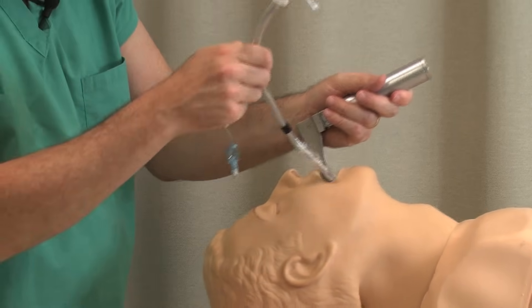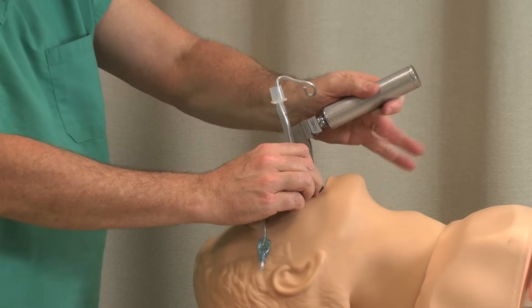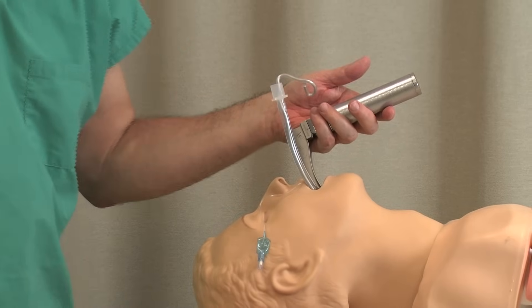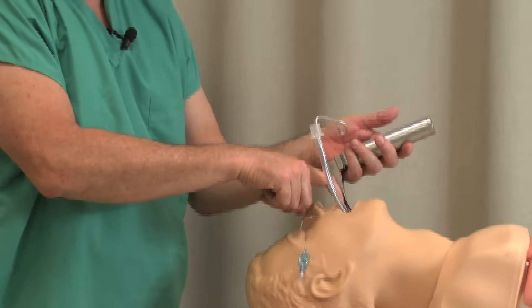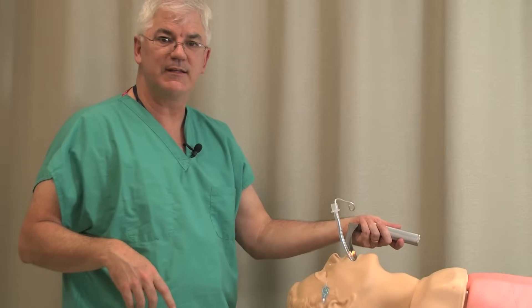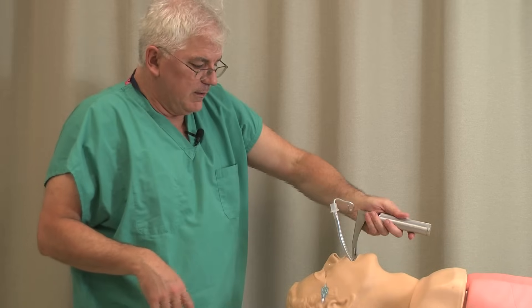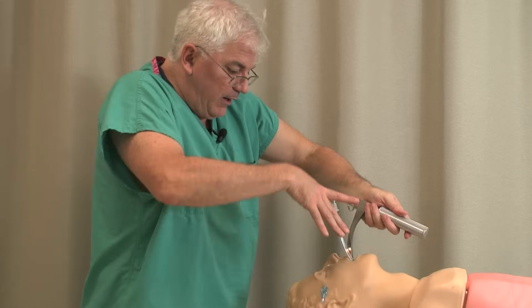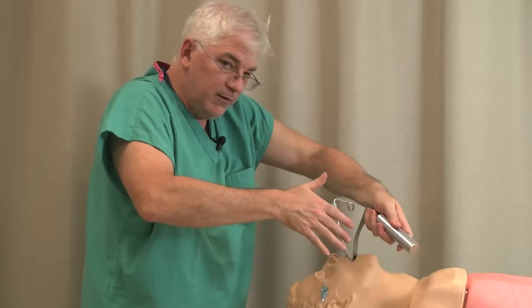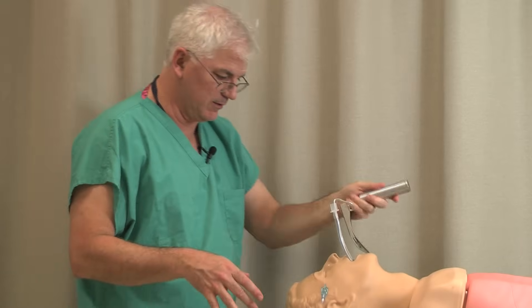You want to lubricate the endotracheal tube before you put it in. Once that's in, don't be careless and just yank the laryngoscope out — the tooth doesn't care if it gets chipped going in or coming out. Just as you were careful putting it in, be careful coming out. Don't just go yank it, because I've seen teeth get broken that way too.